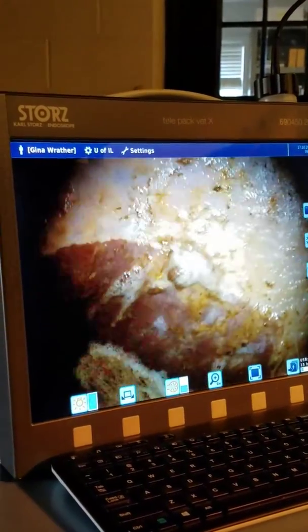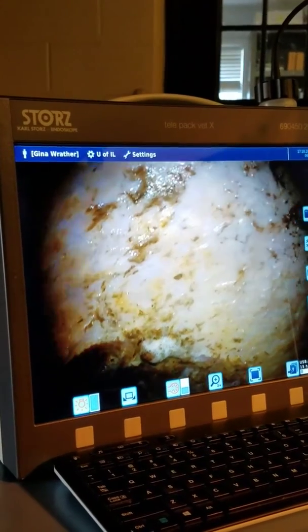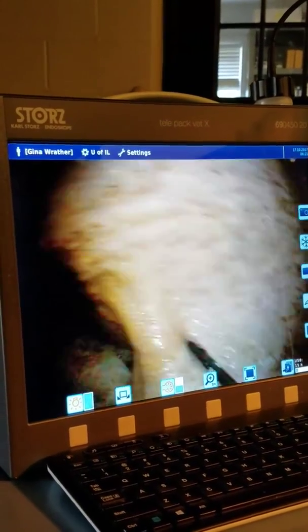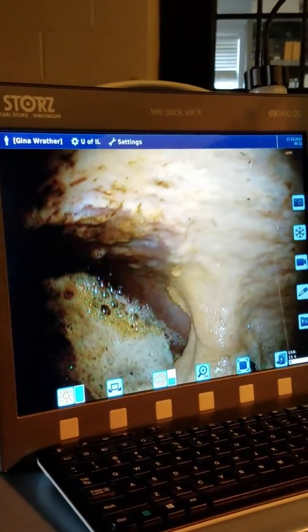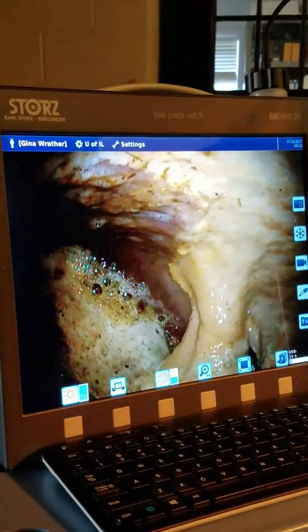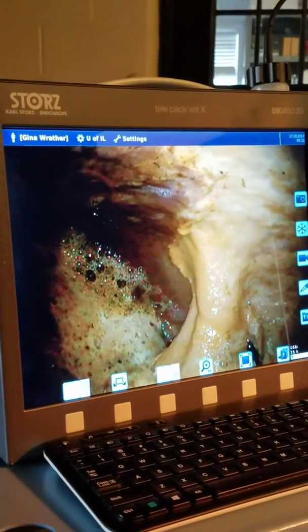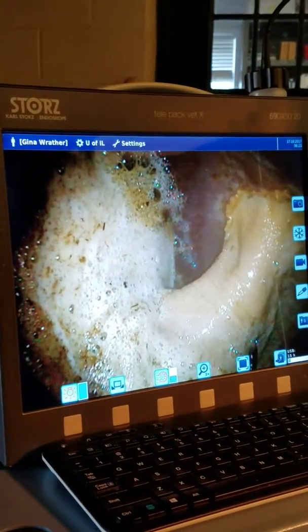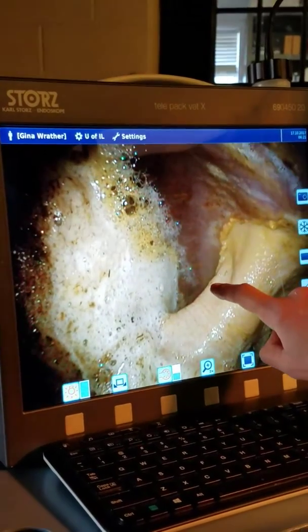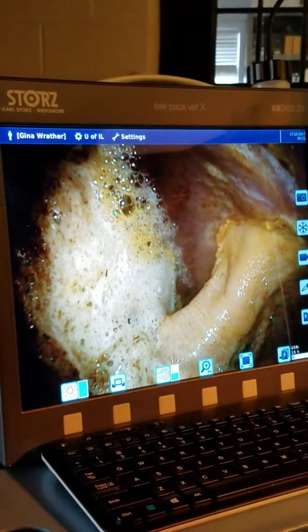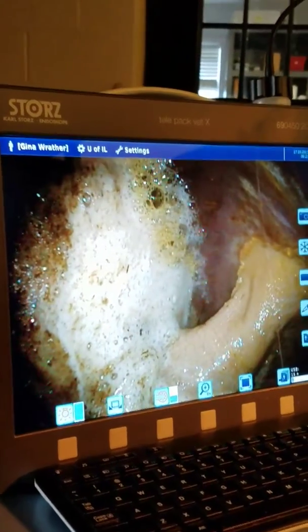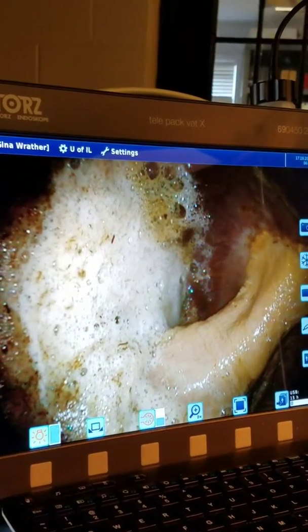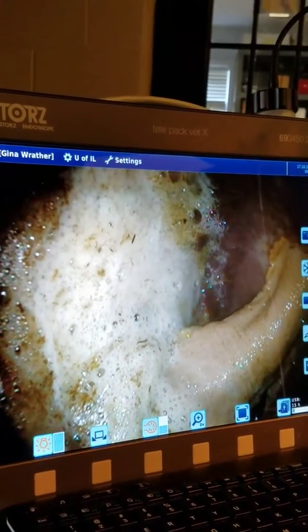That smaller curve over there that we were looking at earlier definitely had a few spots on it, and I'll try to point them out. There are just kind of these little, almost islands of tissue with a little hole in the middle. Those aren't super active ulcers, but he's definitely had ulcers there before.